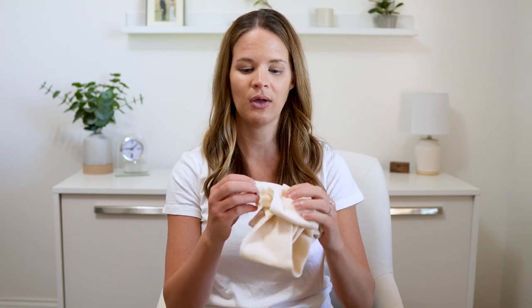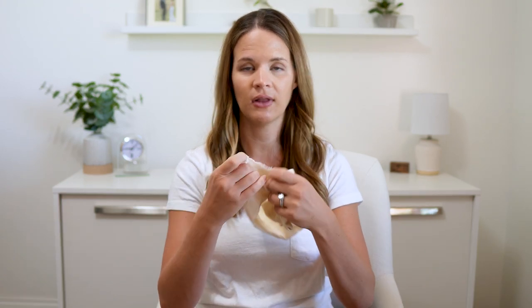Then we're also going to have our compression bandages ready — these are short stretch bandages, specifically Comprilan bandages, meant to help reduce swelling. They are not ACE bandages; these are different and special. Lastly, this is optional: someone might want TetraGrip or TuberGrip, some sort of liner you can put over the top of the bandages at the end to keep everything in place longer rather than having them slide down. And don't forget your tape — you can use masking tape or medical tape. I'll give some options below.